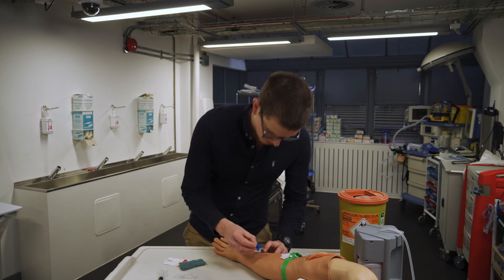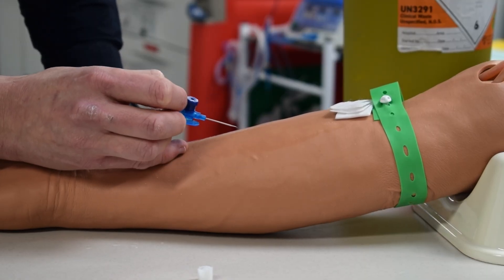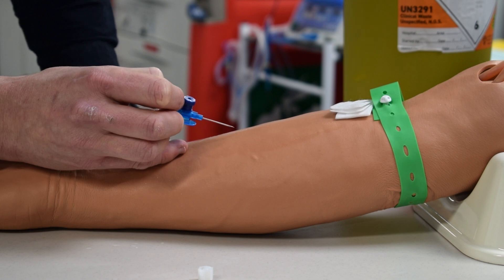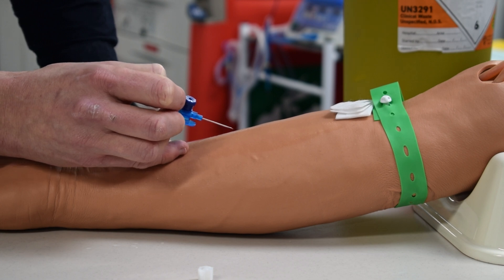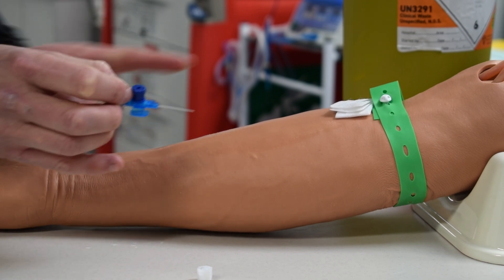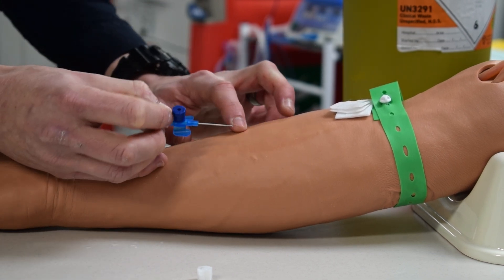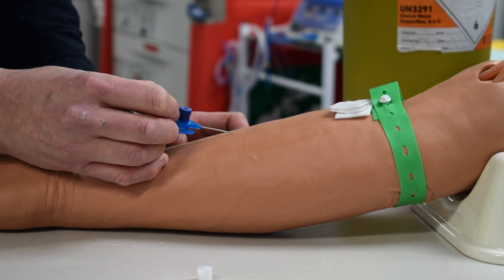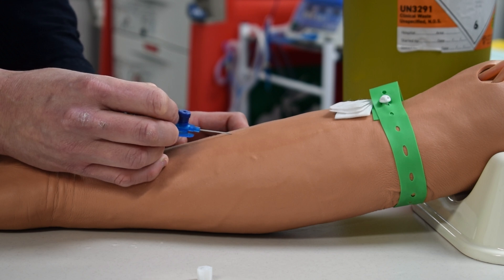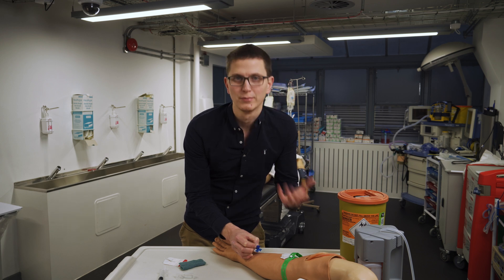The trick here is that typically you'll hear to go in at 45 degrees. I find that's sometimes too deep or too large an angle and we just tend to go straight through the vein because the vein is traveling at a shallow angle. I find that going in at a much smaller angle works much better — right close to the skin — especially with elderly people or people who are diabetic.